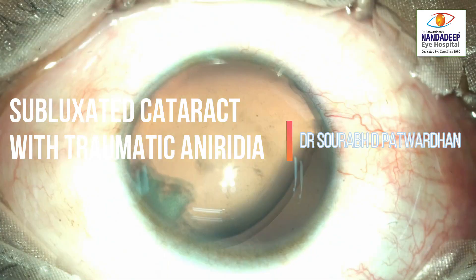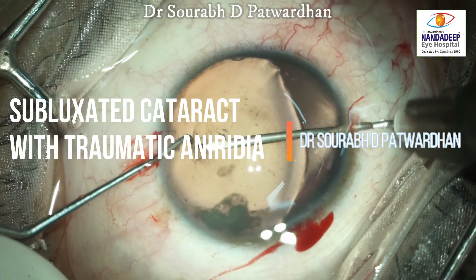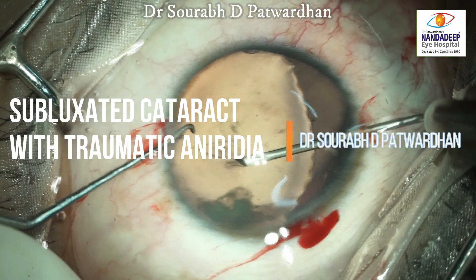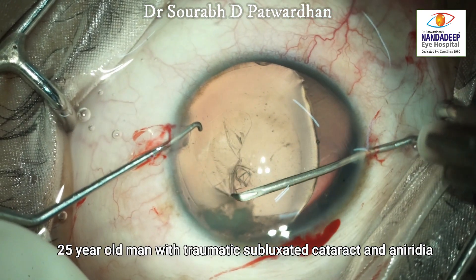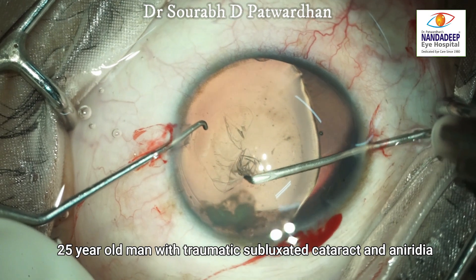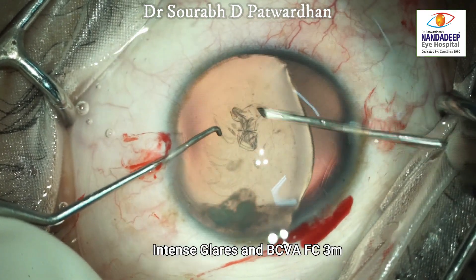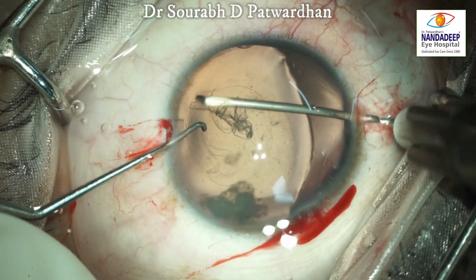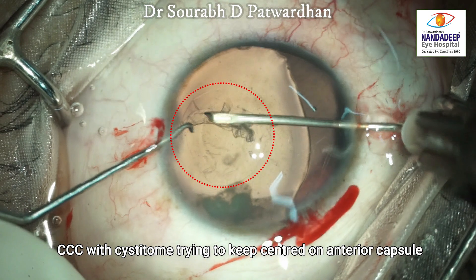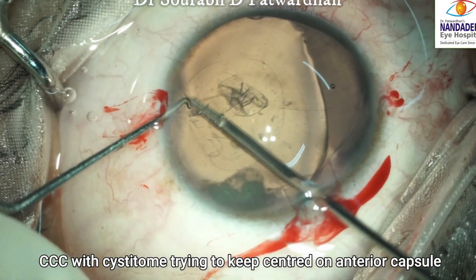Now let's move on to some surgical cases. This is a case of traumatic mydriasis almost looking like aniridia. There is subluxation of almost six clock hours or more. The important step is to do a good CCC. You start from the area of good zonular support and then move on to the weaker area, trying to center it imagining the final position of the lens.